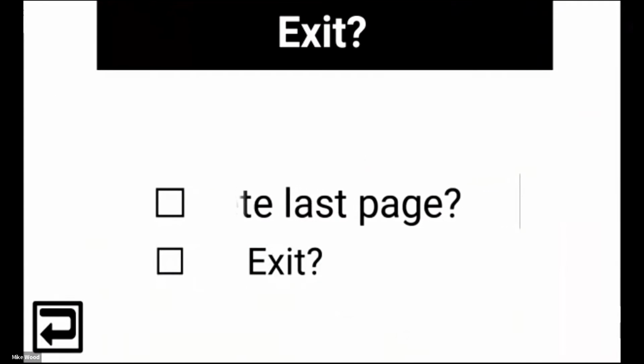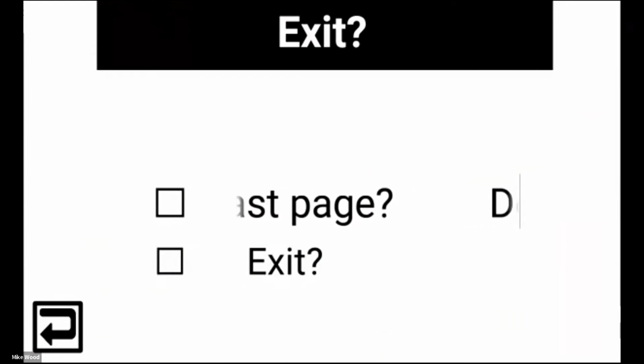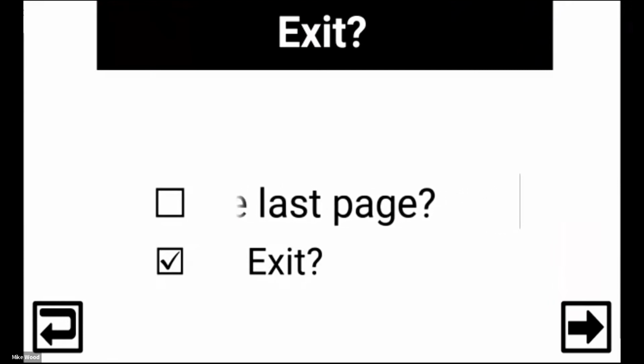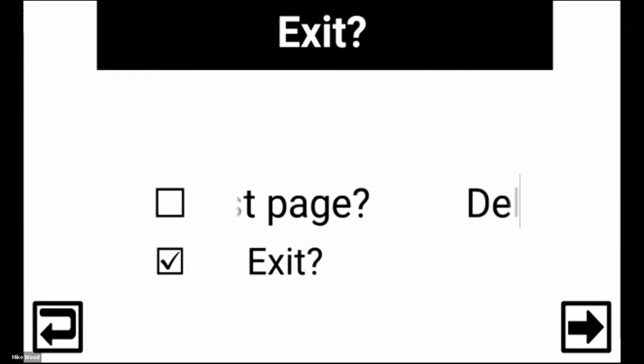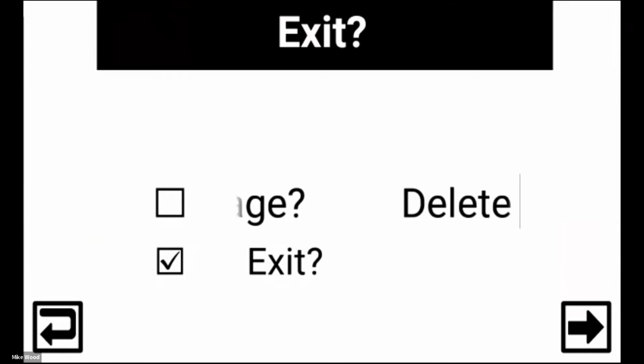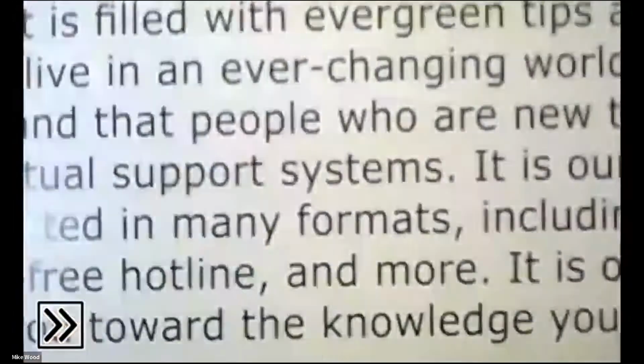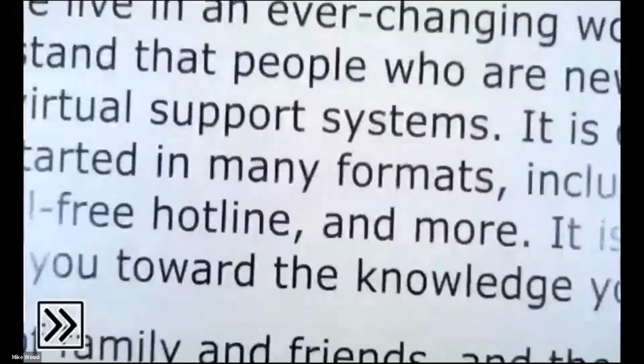And it will say delete last page, or do I want to exit? And for me right now, I'm going to exit. And I'm going to then hit the right-hand arrow to move forward. And that's closing that document. And that just brings me back to my main page. Is that grandma there that you were bringing the brownies to? And then I'm back to my live view.